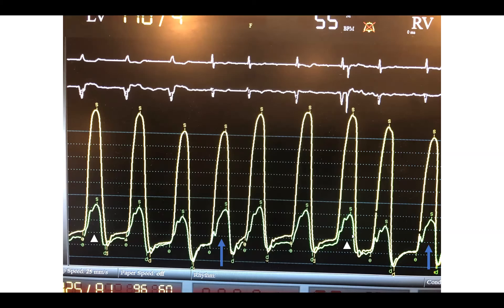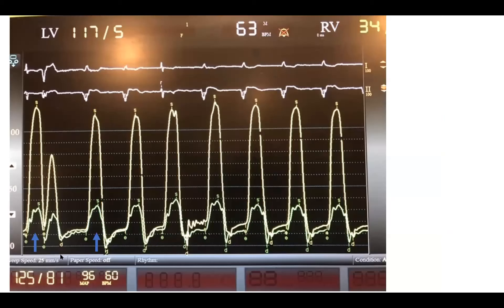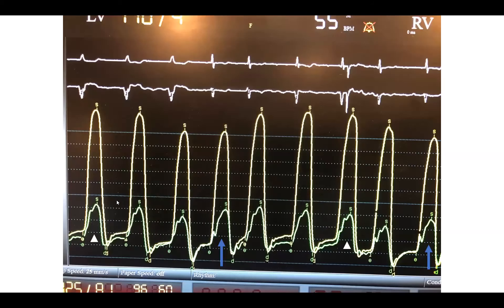So here is discordance: LV high, RV low on expiration; LV low, RV high on inspiration. To catch this, some practical advice: obtain long recordings and be patient, obtain multiple recordings and look for overall trends. Ask the patient to take a deep breath — that will make variations more pronounced. Try to induce a PVC, which may help make things clearer. Here, after a PVC, it's clear that the RV got bigger whereas the LV got smaller — the RV's bulk increased while the LV's bulk decreased.